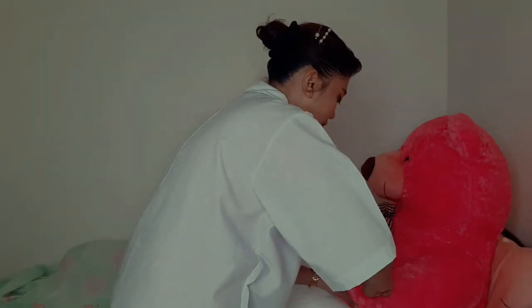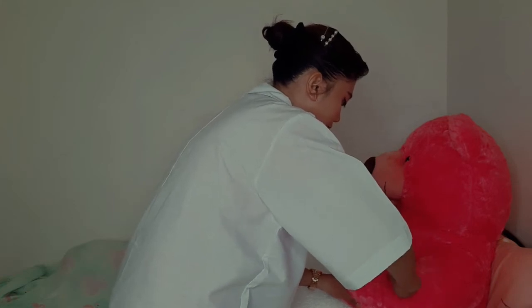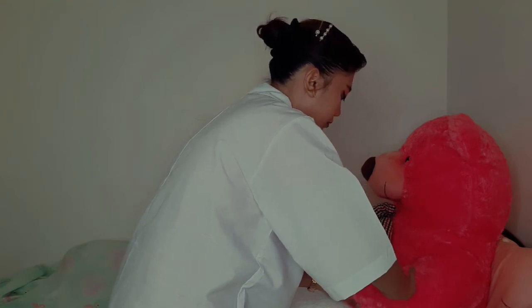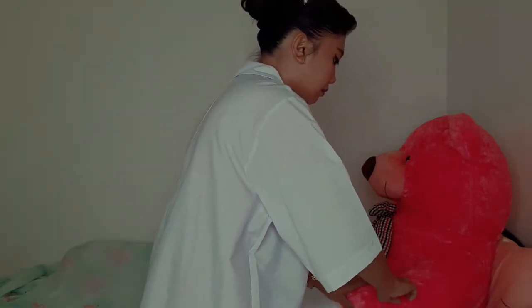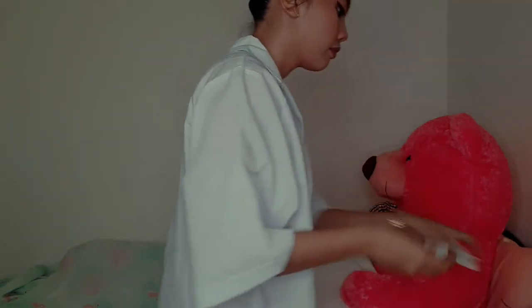Palpate the skin for induration or tenderness. Remember that the ideal injection site must be free from scar, mole, lesions, wound, rashes, or any other disturbance of tissue growth. A possible injection site in the inner forearm is a hand's width above the wrist and 3 to 4 fingerbreadths below the antecubital space.